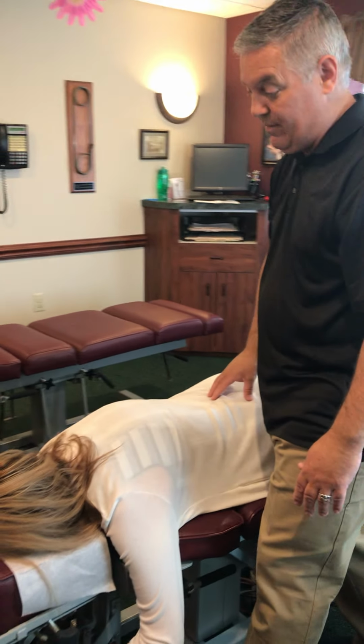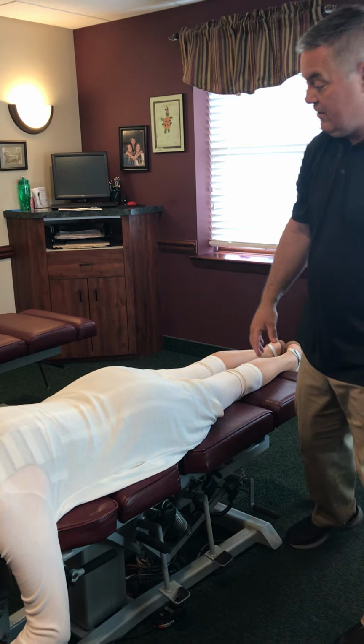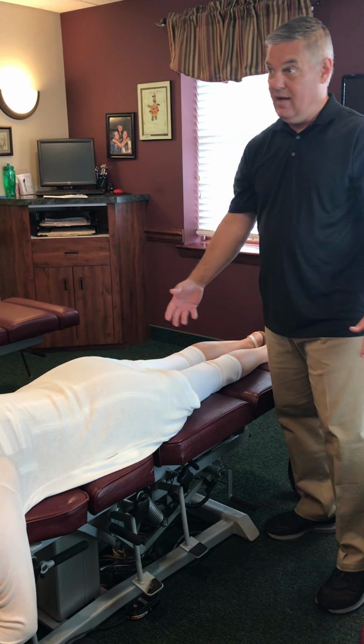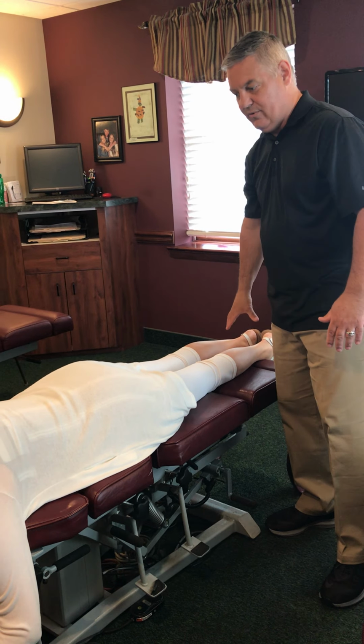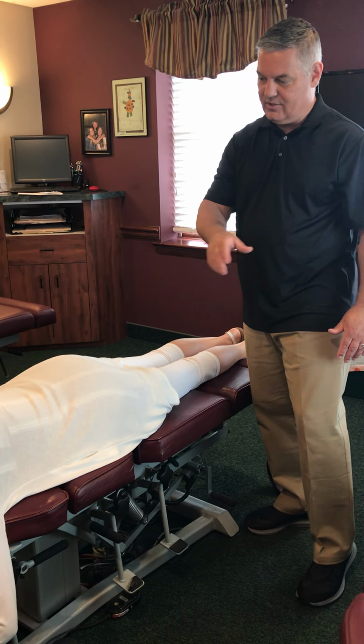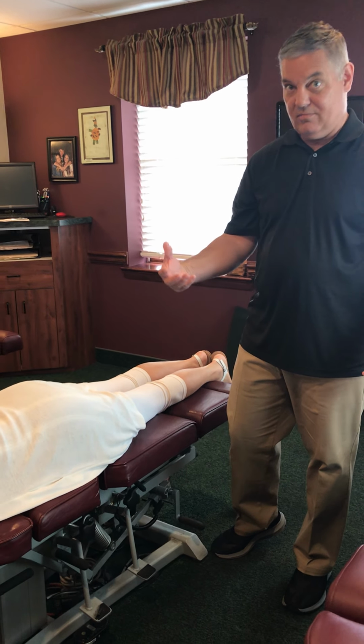From a standpoint of extremities, we do some extremity work. If it's knees, we use the activator. Most often, I do activator challenges just to check there. We do extremities on ankles, feet, wrists, TMJ. So if you're comfortable with any of that, please feel free.